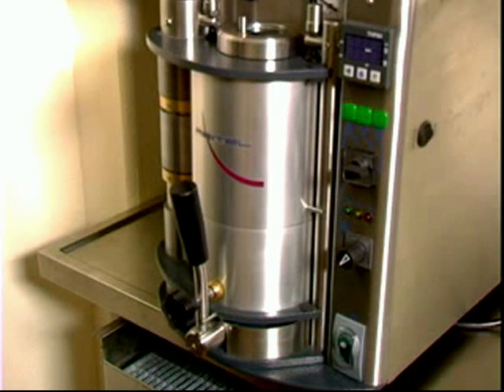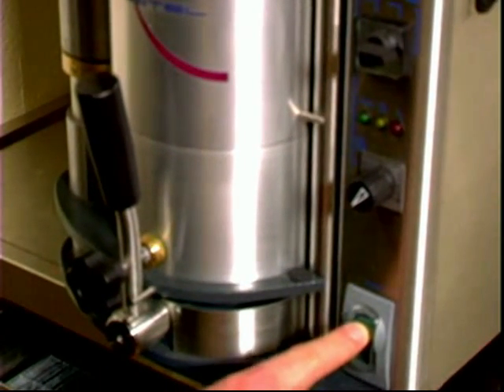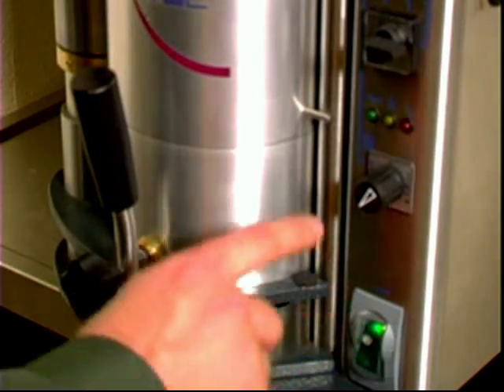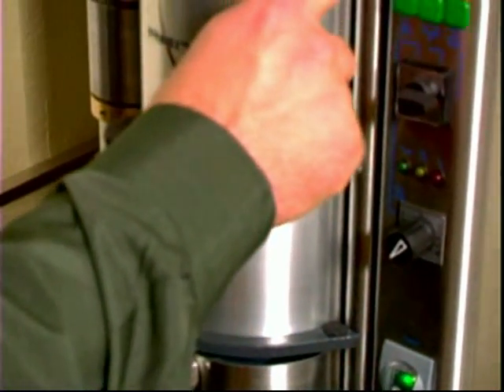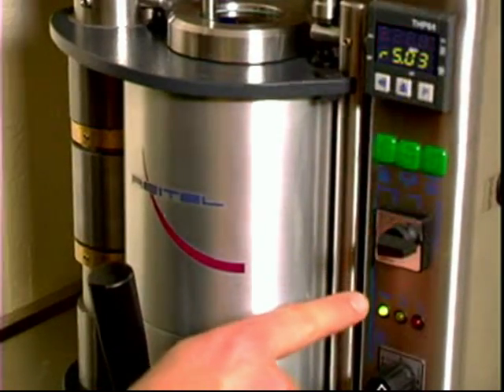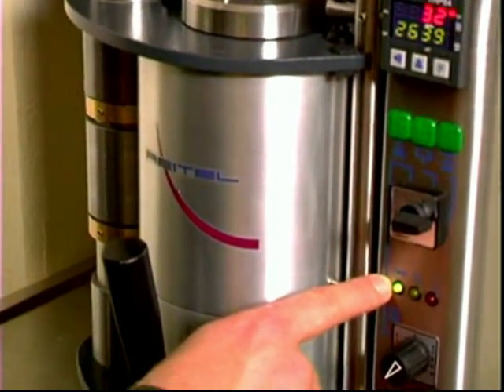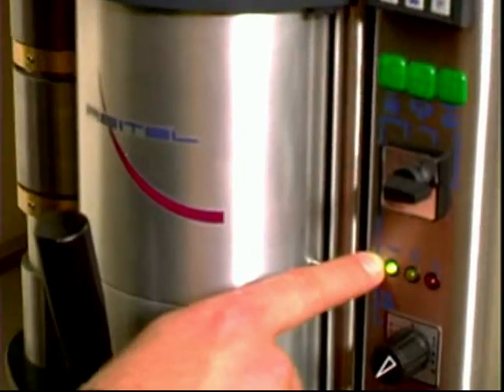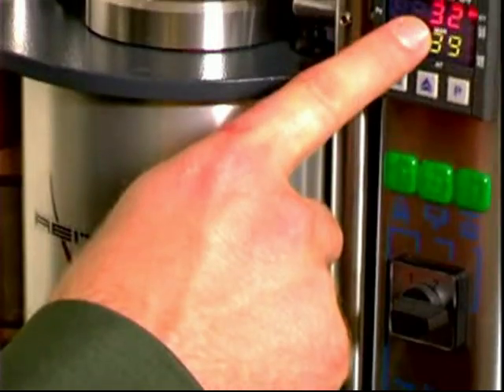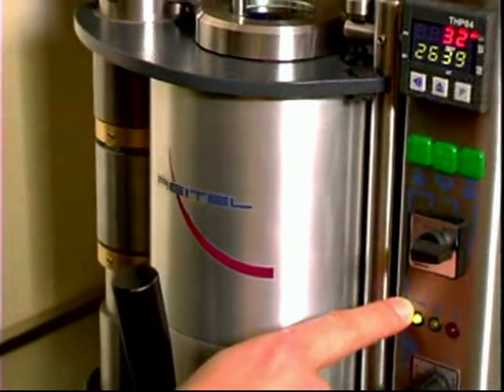These are the operating instructions for the Endure-It compact casting machine. This is the on-off switch. You turn the machine on, and on the digital readout you will see the number 32 and also the green light down here. This cycle will be displayed each time the machine is turned on, which is the checking cycle. The green light should always be displayed and means the system is running safely.